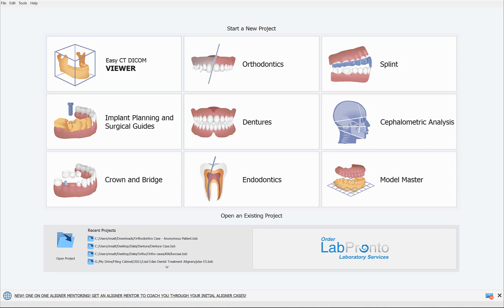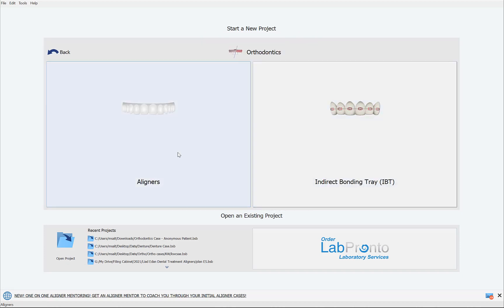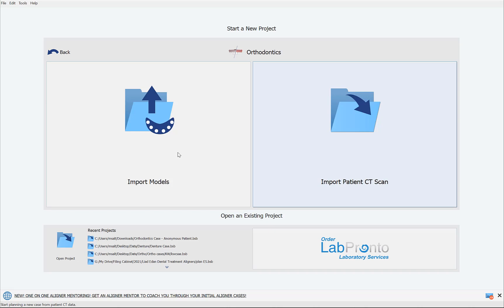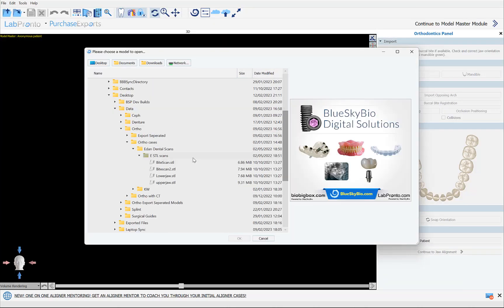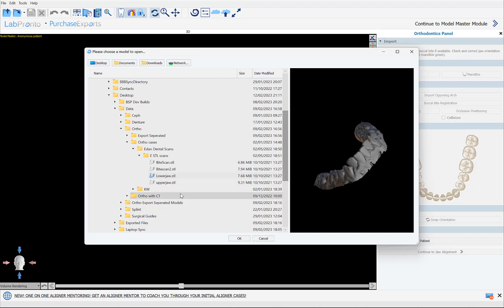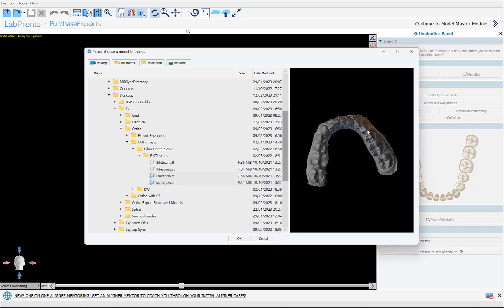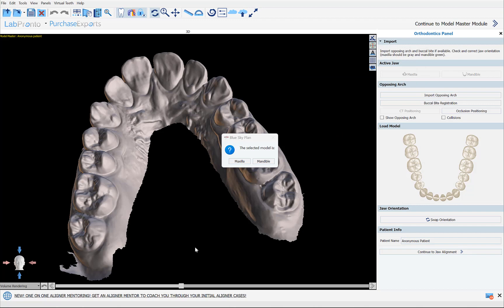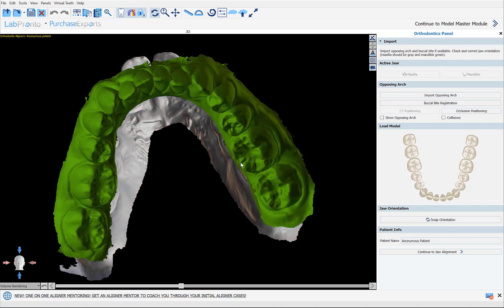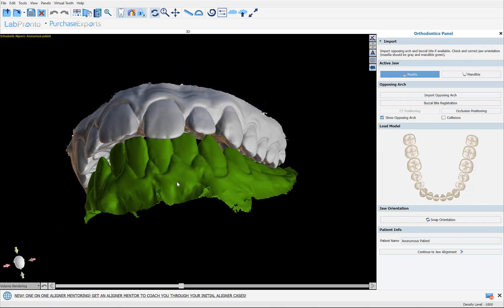Now let's take a look at these features and functionalities directly in Blue Sky Plan. I'm going to start by clicking on Orthodontics, Aligners, and Import Models. I'll select the relevant models by holding down the shift key, left clicking once on each model, and then clicking OK. The software shows us the first model and asks for identification — we're going to click on Maxilla and our models are imported.